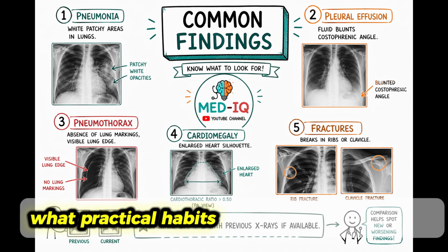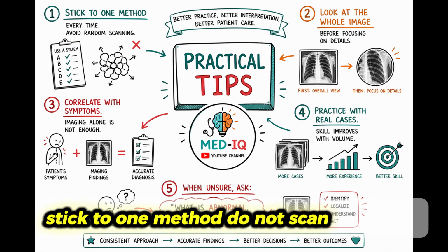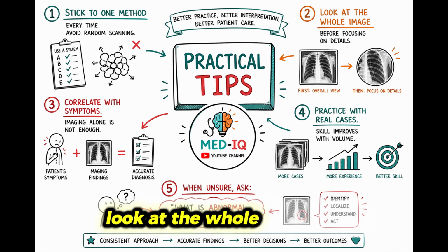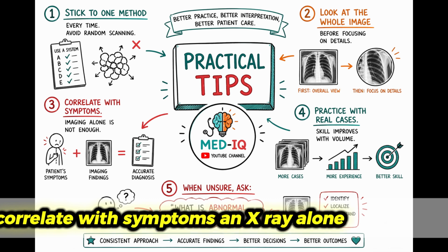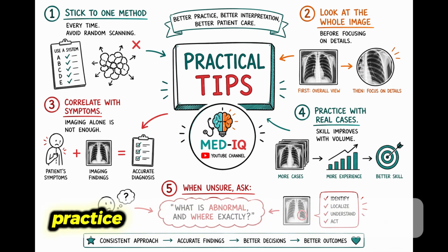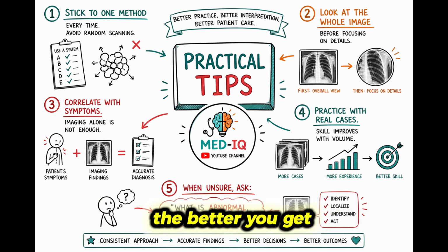What practical habits make you better at this? Stick to one method. Do not scan randomly. Look at the whole image first, then focus on details. Correlate with symptoms. An X-ray alone is not enough. Practice with real cases. The more you see, the better you get.